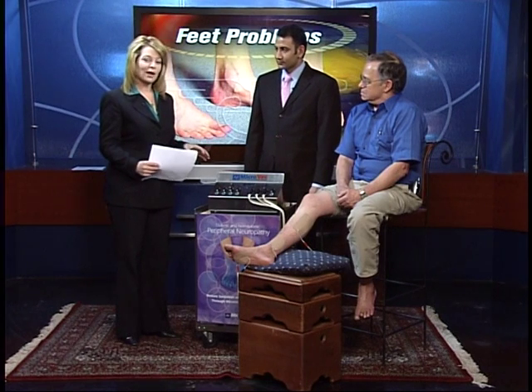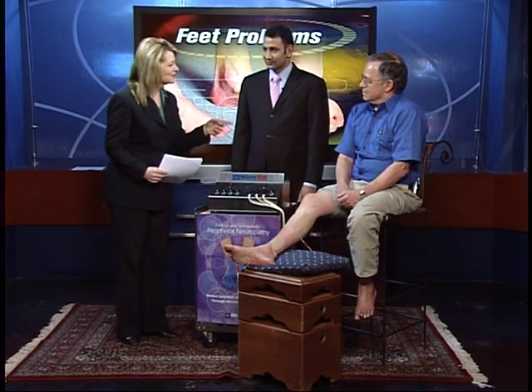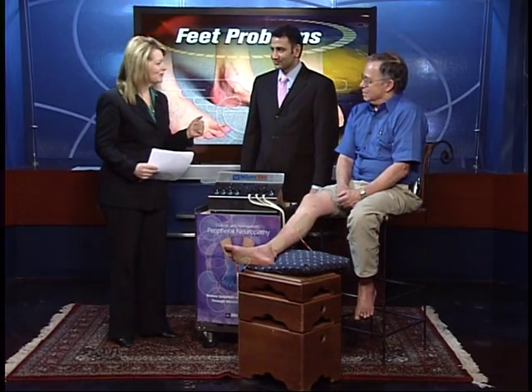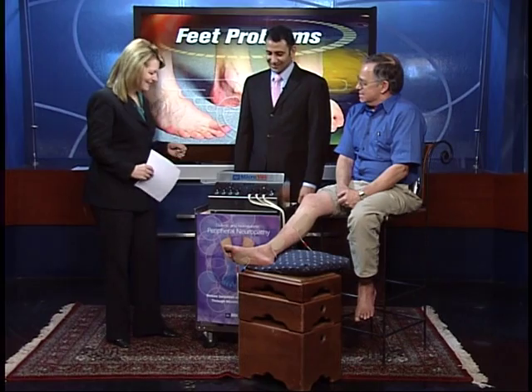I should point out that this is the first time that John is getting this treatment, so we get your actual reaction first time out. You're a guinea pig for us. Is that okay? It sure is. Go ahead and show us how it works.